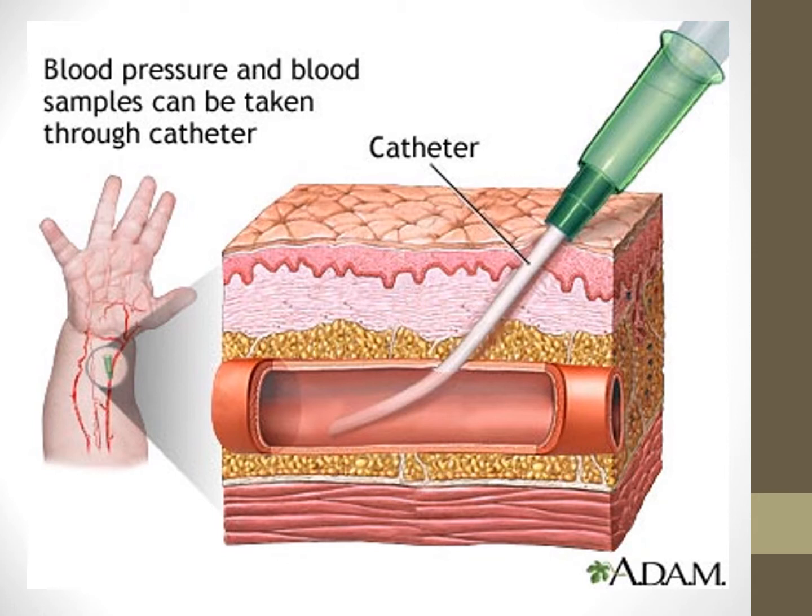So if the patient bends their wrist, it can be very positional. If the wrist is bent, flexed or extended too much, either way can also affect the readings. It might even also affect the ability to draw blood as well. So we'll see this for patients that have A-lines in for a longer period of time, and hopefully they're not in for too long, but if they're in for a longer period of time, they might have to either switch location, or altogether just go off of the A-line, because it can be very positional, especially the longer it's in place.